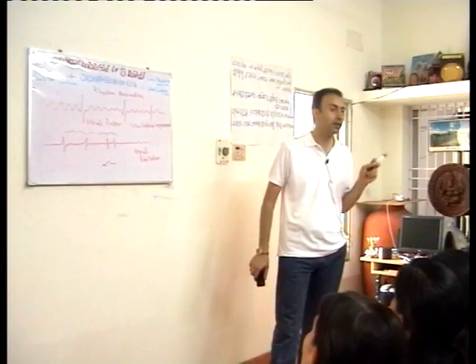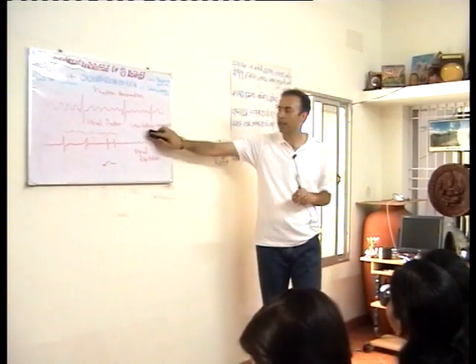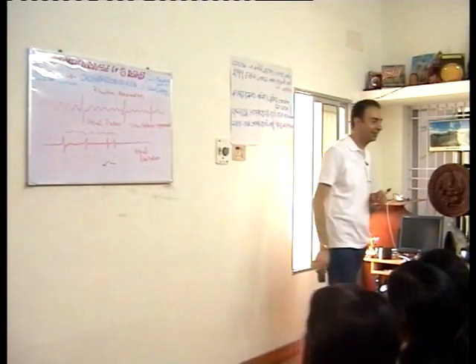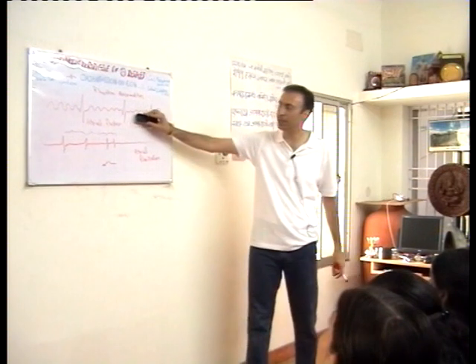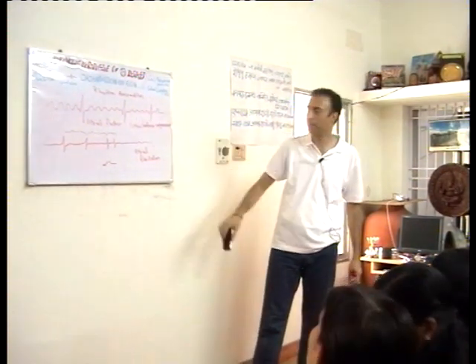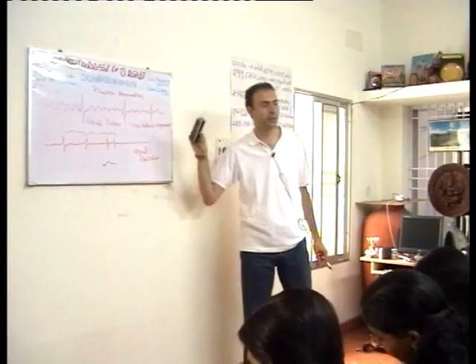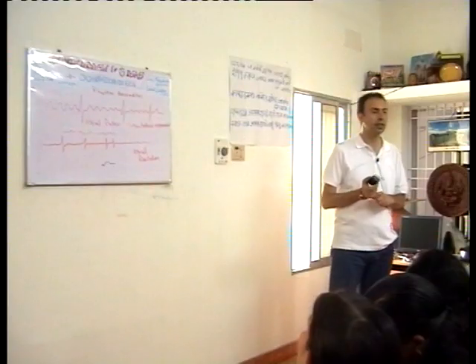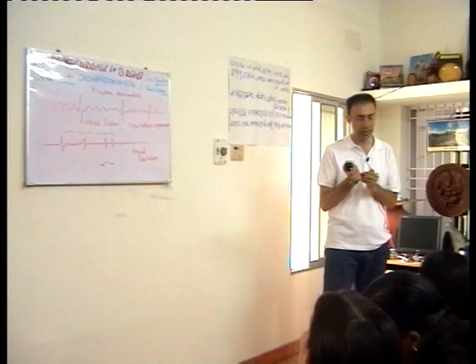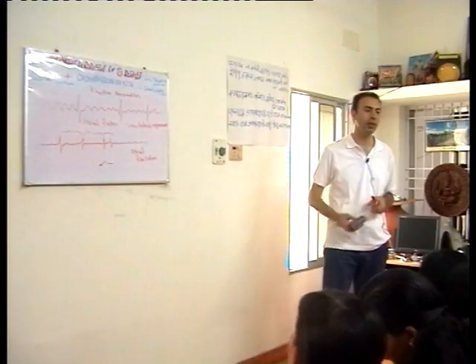Sick sinus. Very good. In atrial problems, yes, atrial flutter, in which we see sawtooth appearance, dangerous ones. So these are the most important ones in the sinus and atrial. After that, we actually start with the AV conduction abnormalities and ventricular conduction. Okay?